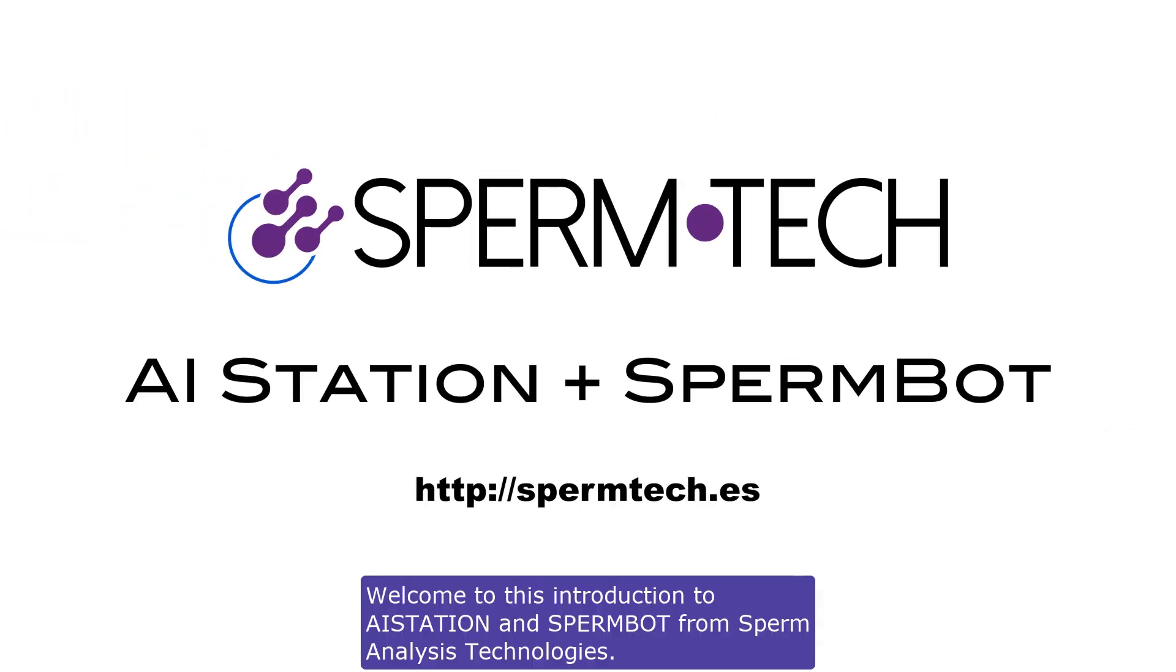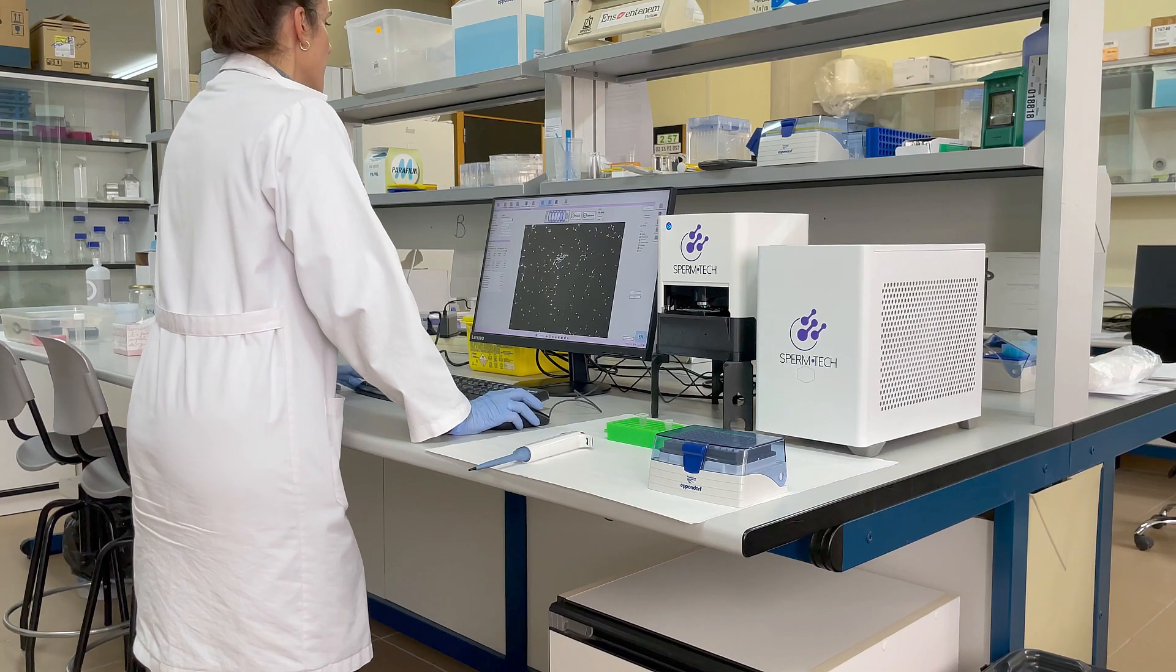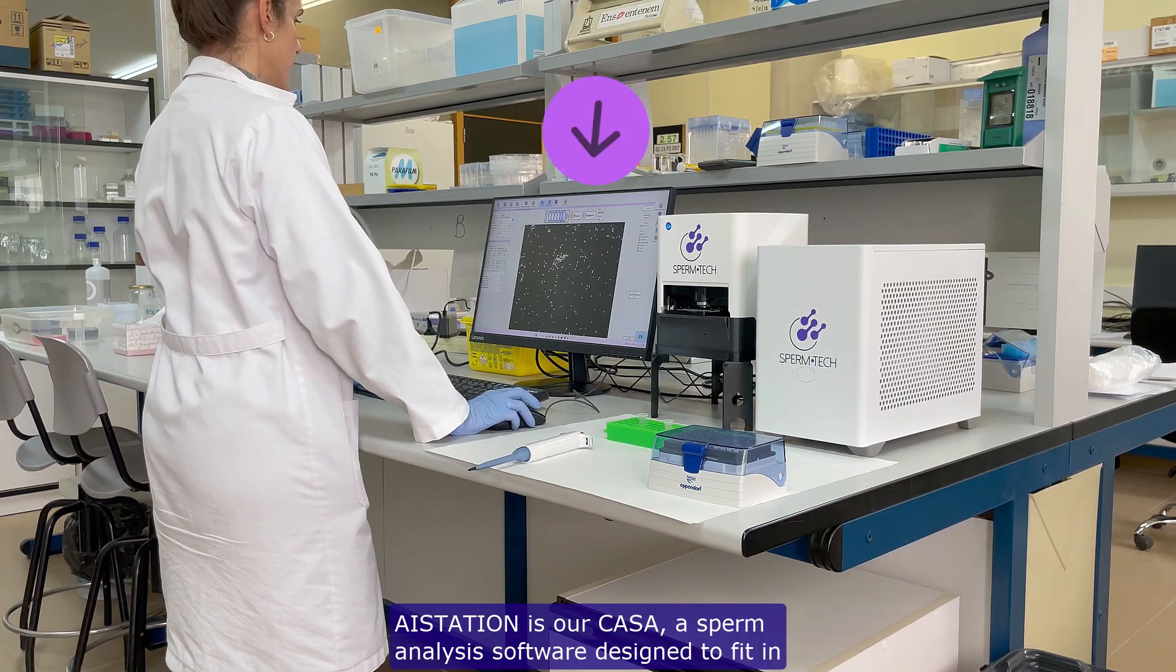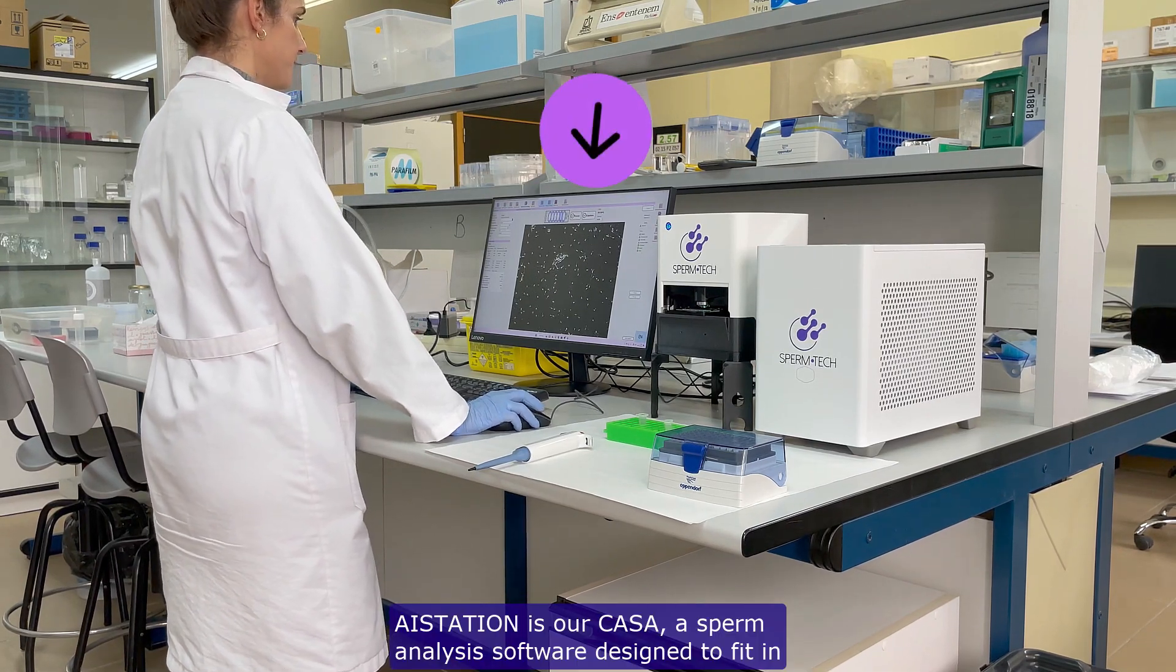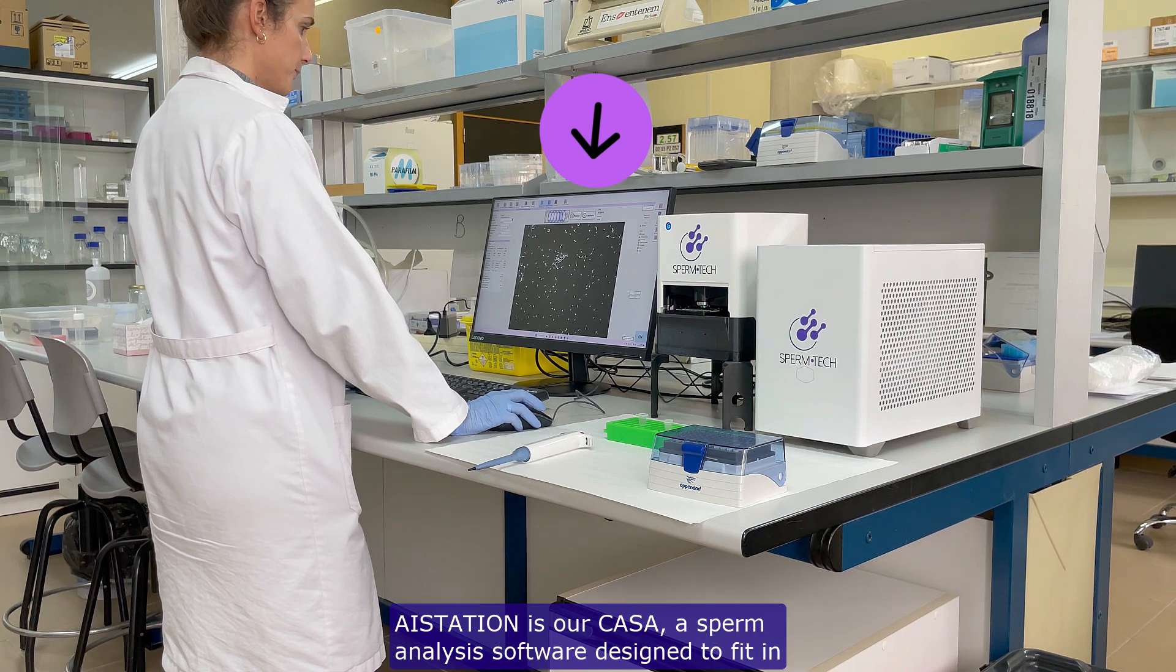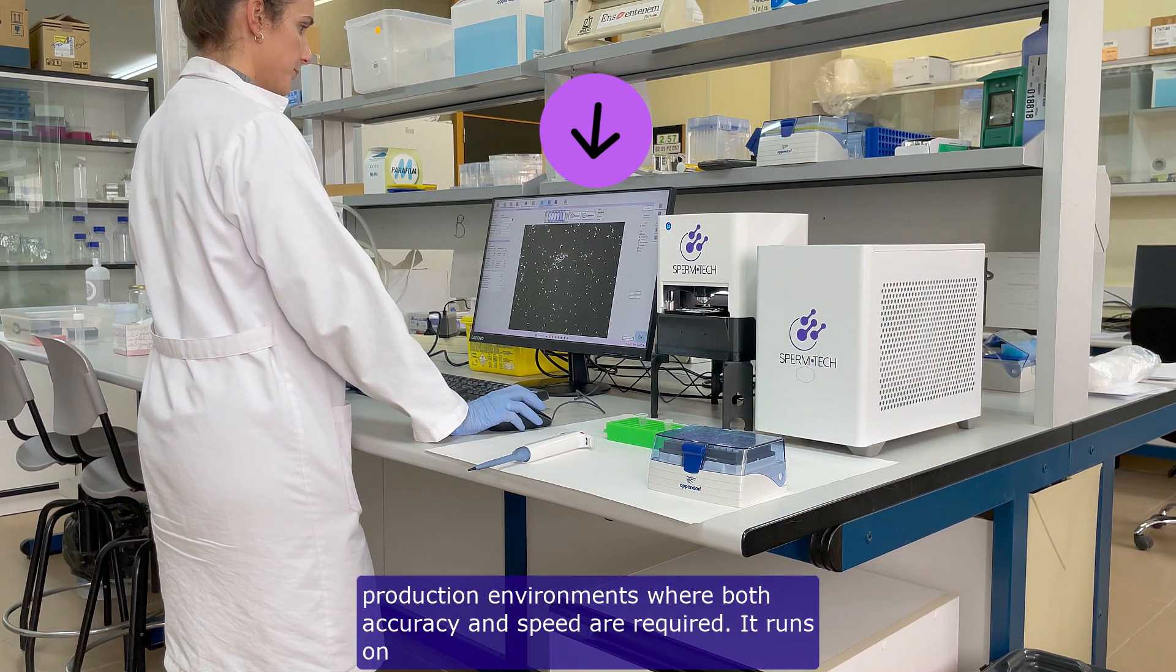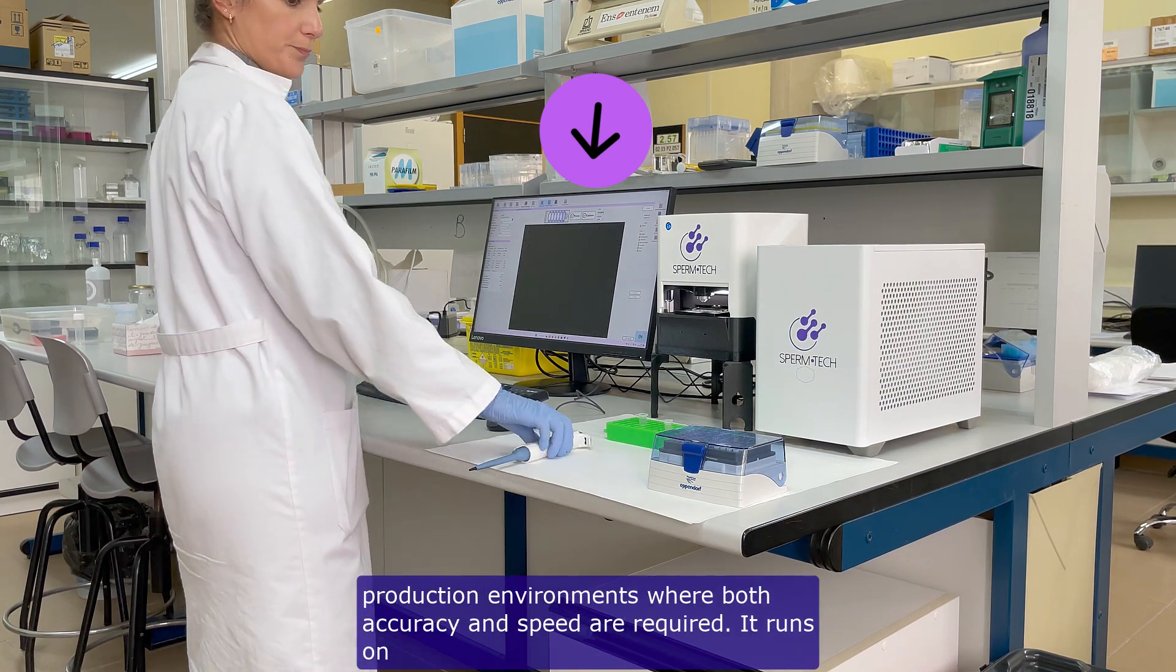Welcome to this introduction to AISTATION and SPERMBOT from Sperm Analysis Technologies. AISTATION is our CASA, a sperm analysis software designed to fit in production environments where both accuracy and speed are required.